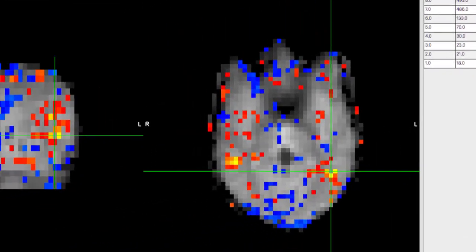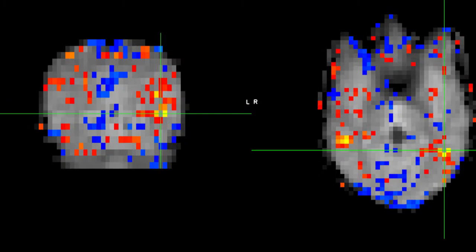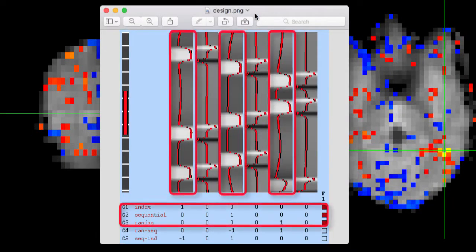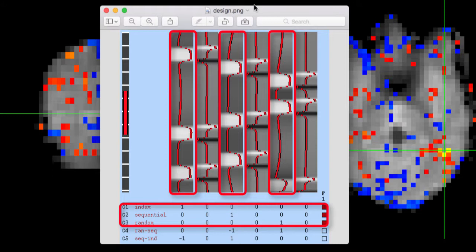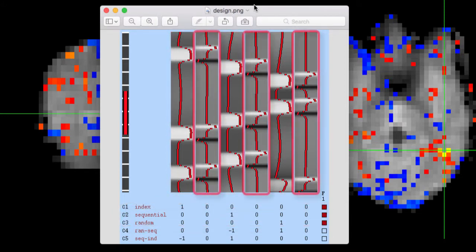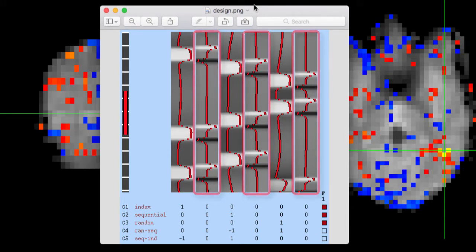In this case, we have three regressors, which you can see in the design.png file that's generated after you specify your model. The three main regressors are called Index, Sequential, and Random, with each trial of each regressor lasting about 30 seconds. We also have time derivatives added to each regressor to account for any variation in the rise and fall of the HRF.